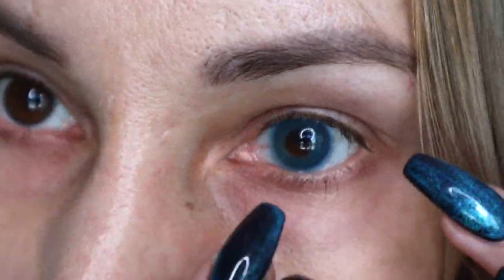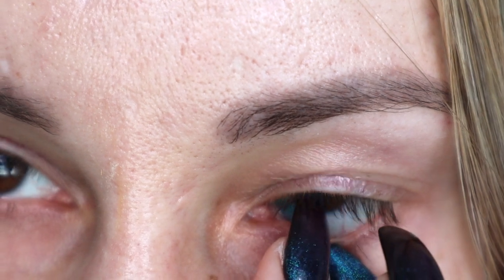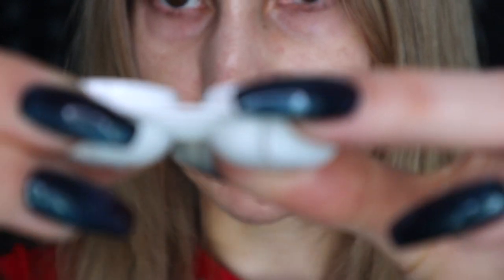Same thing with the other eye. It doesn't really matter which hand you prefer for removal, but for me it matters when I put them in — I like to use the same hand for the same side. So the hand that applies the contact lens on one side is always the same hand for that eye, and the opposite hand does the other side. That way you can remember which eye you're working with and which finger is placing the lens.